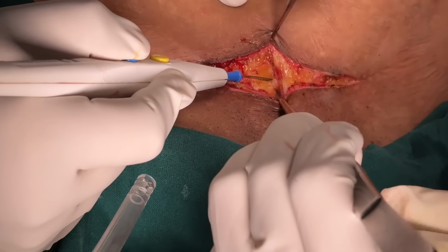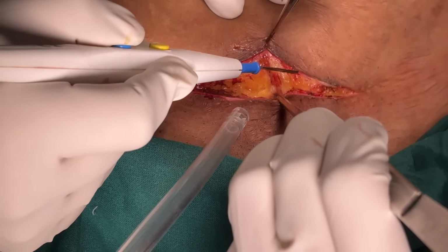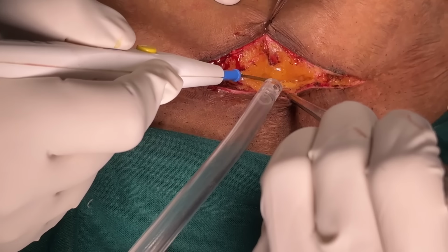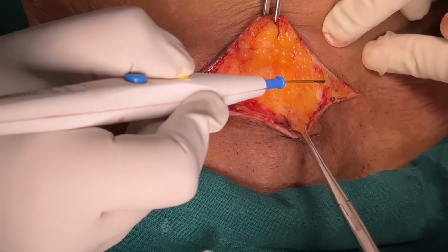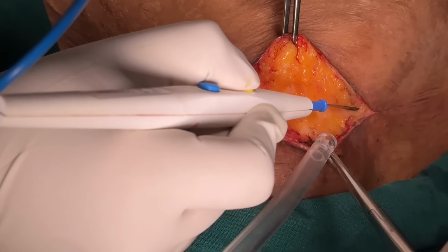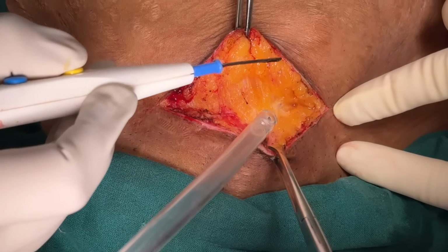Now, in cases of previous surgeries, especially one like this who has already undergone two cesareans with the same incision, you expect tougher tissues, a little more bleeding, and also adhesions between the layers as compared to a person where this surgery is the first one.